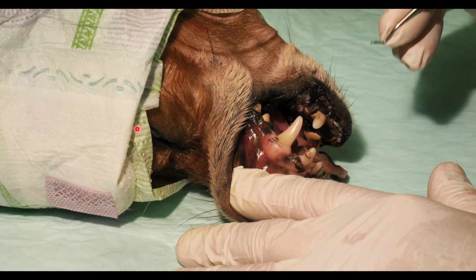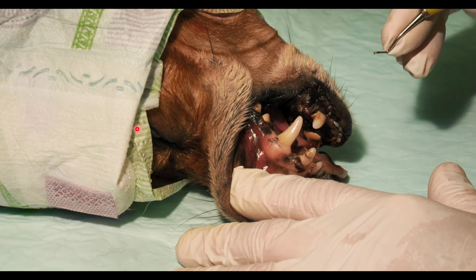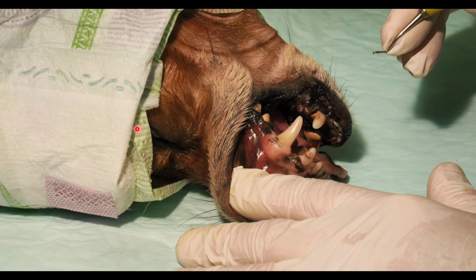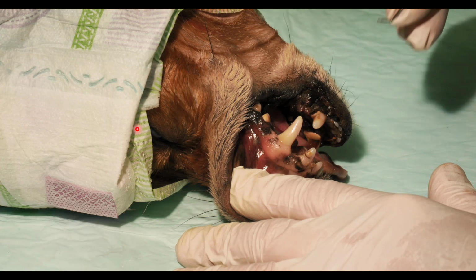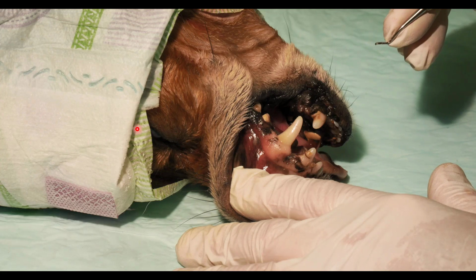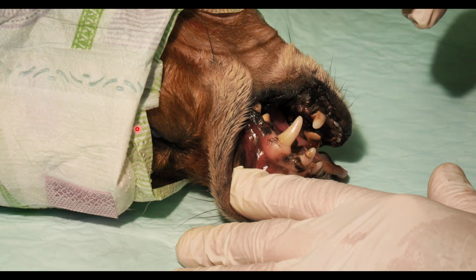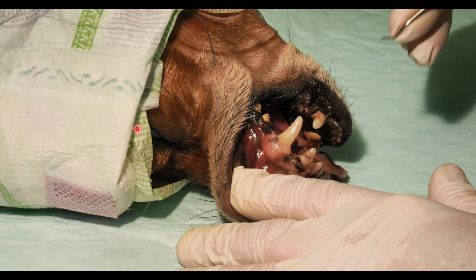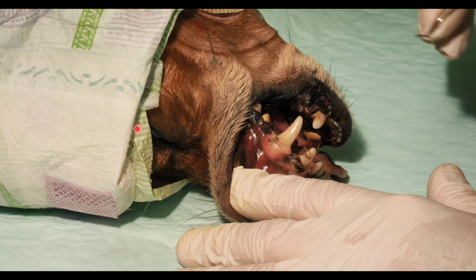When you find a 5mm pocket in a dog, you have gone from preventing disease to treating disease, and you need to charge for it. And so I would do the subgingival hand scaling, I would do a nerve block, I would take an x-ray, I would put in Clindoral or Doxirobe, and I would charge for every step. That's a key in making your dentistry make sense.